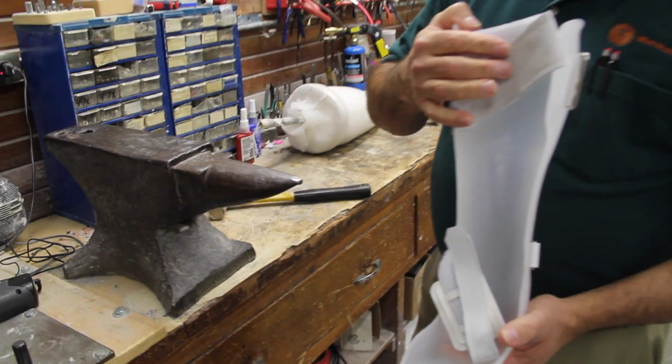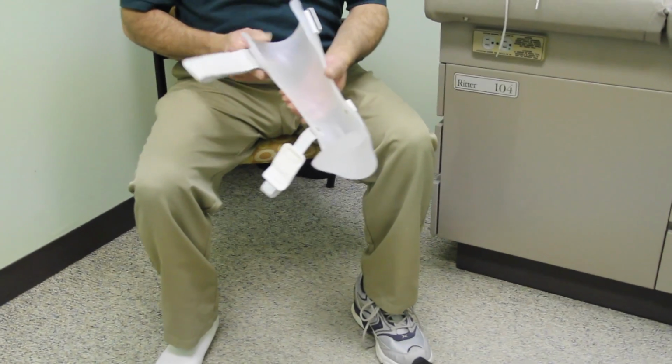And that's it. We're all done. The final stage with the custom fabricated AFO is the actual fitting. We have properly fitted shoes with extra depth support. So we'll place the brace on our patient.